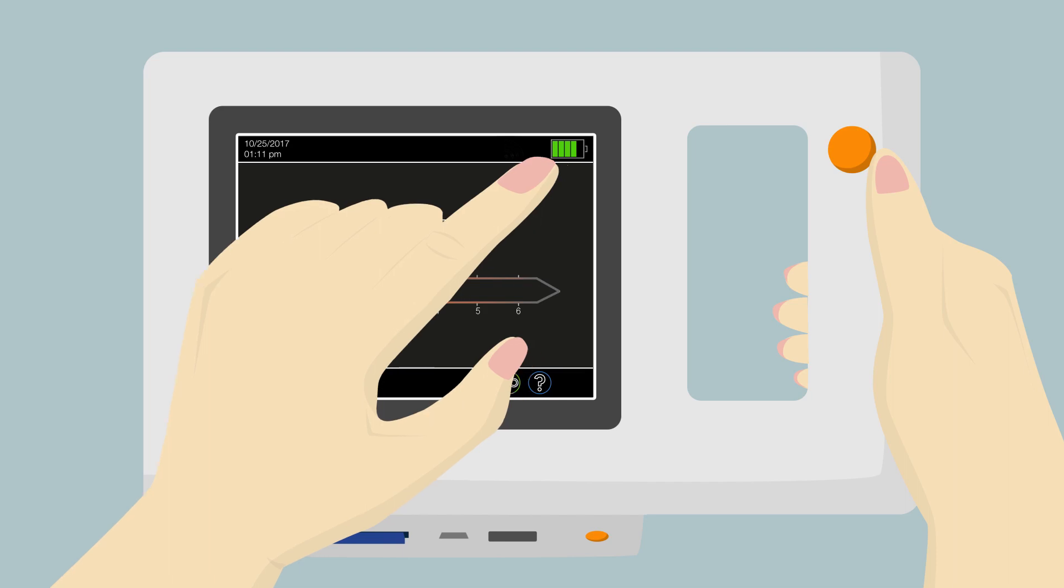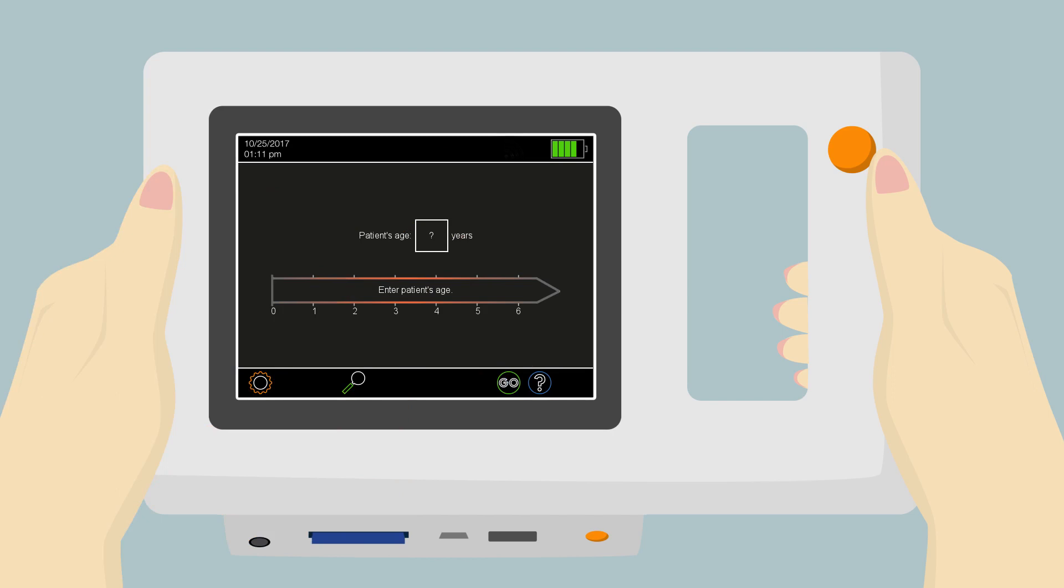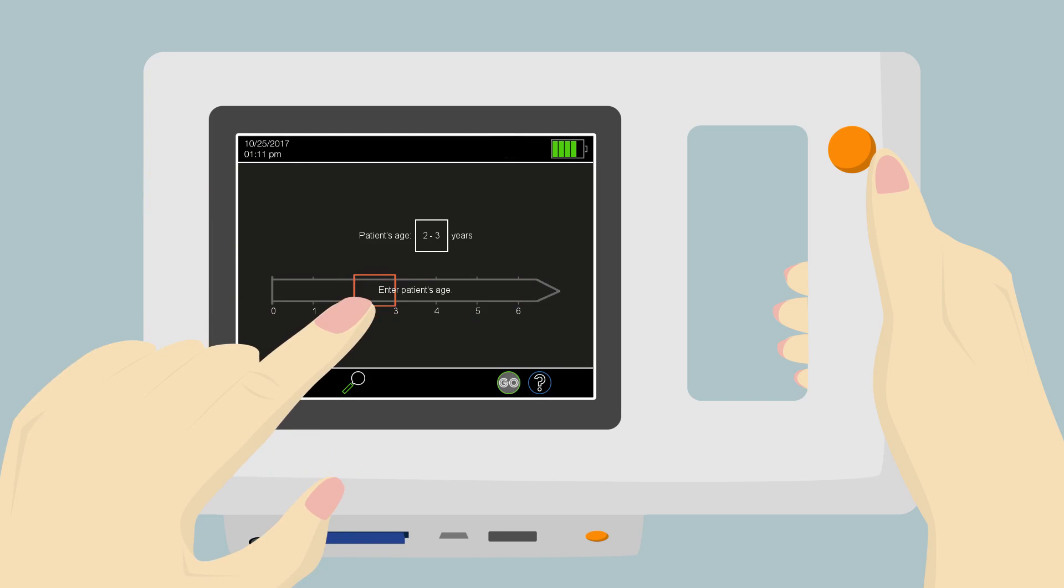She is now ready to start the measurement. This is the home page. If Anna does not see this page, she simply presses the shutter button on the handle once. The referral criteria are age-based, so it is important to select the correct age of the patient by touching the corresponding section on the timeline. Look for the Go button in the navigation bar. If it is blinking, a new measurement can be started.